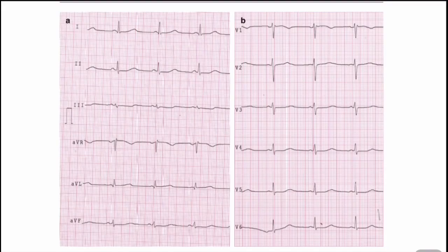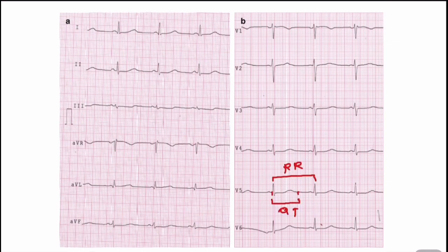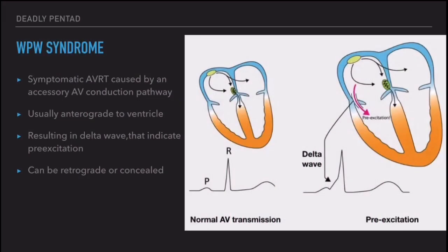In this ECG, we can see the QT interval is more than half of the RR interval — so this is a case of long QT syndrome presenting with syncope. Coming to the next ECG pattern: WPW syndrome, that is Wolff-Parkinson-White syndrome.